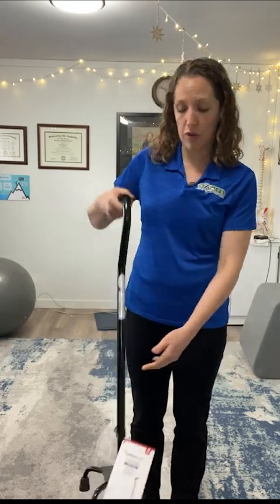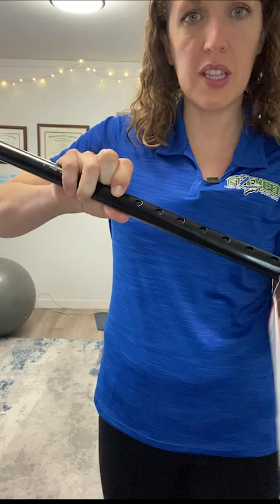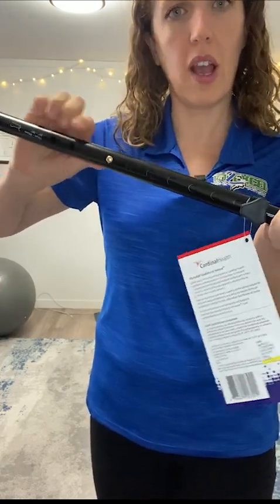The other thing is you want to make sure it's the right height for you. When you put the cane directly beside you down on the ground and put your wrist down, it should hit you right there at the wrist. If it hits you lower, it's too short; if it hits you higher, it's too tall. For this particular cane, it's hitting me about mid palm, so this cane is too short for me. I'm going to adjust it by pushing in that same button, pull it apart a smidge, and there we go — I've adjusted it.